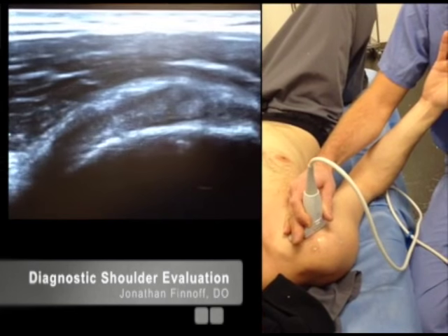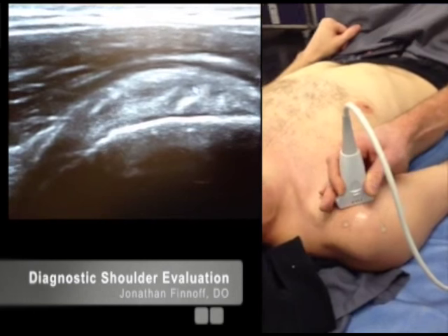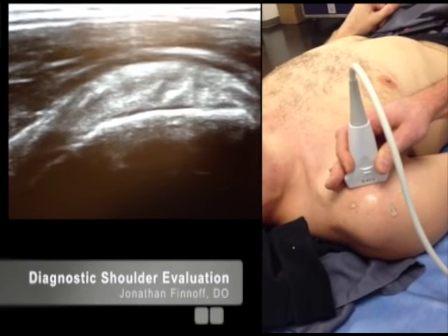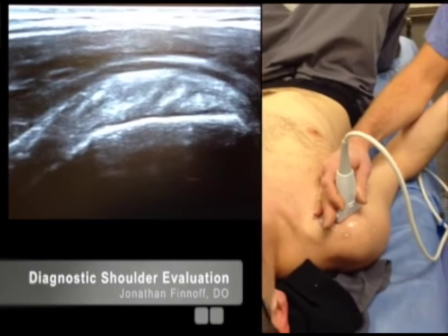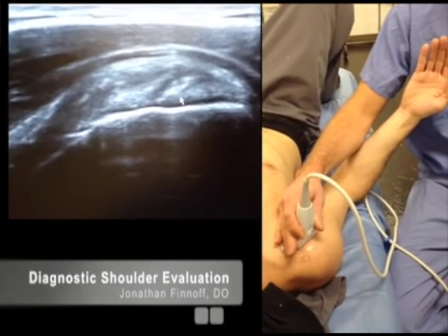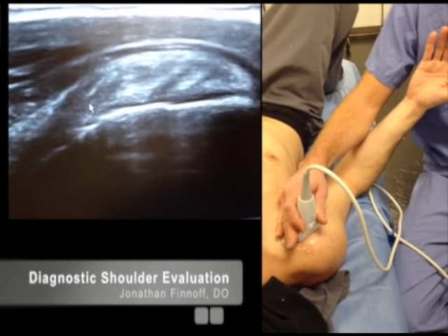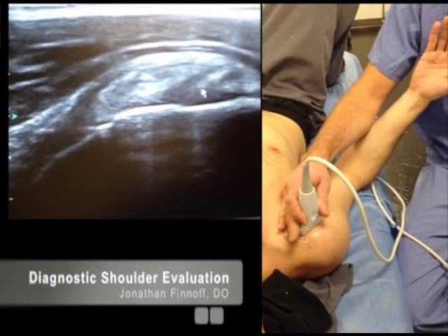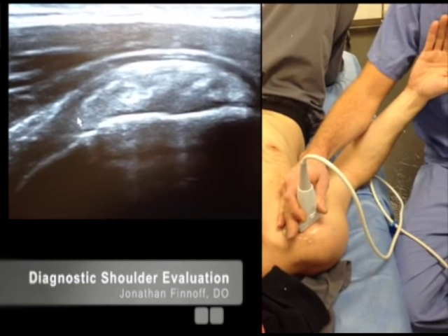As I come around medially, you'll see all of these different musculotendinous slips. That's because the subscapularis has multiple tendons with interdigitating muscle slips between them, giving it a heterogeneous appearance — and that's normal. You want to look for tears, which are most commonly found in the cephalad portion right next to the rotator interval. They usually occur there and then propagate caudally, so always make sure you look at that cephalad margin of the subscapularis.